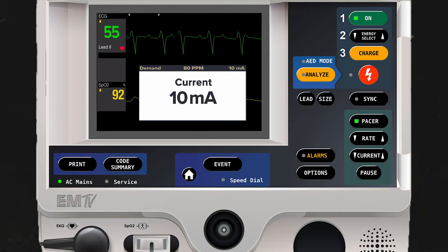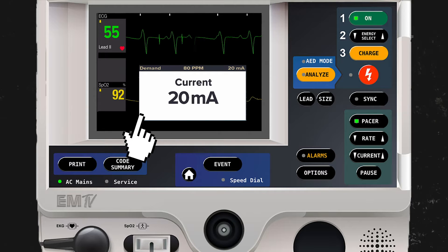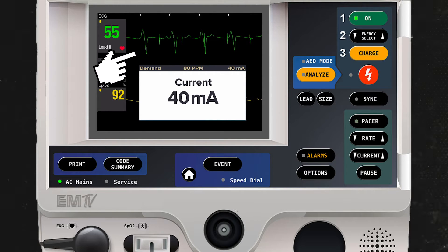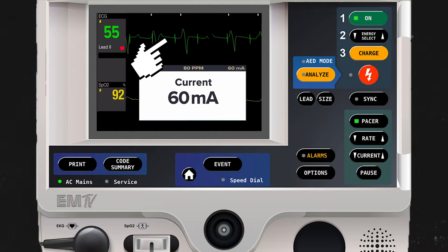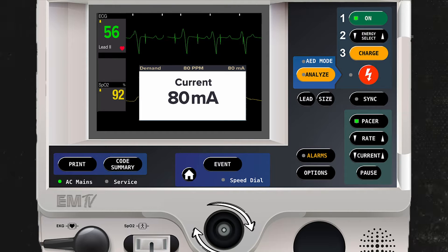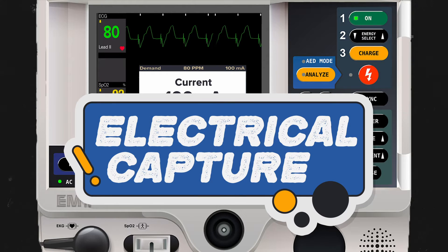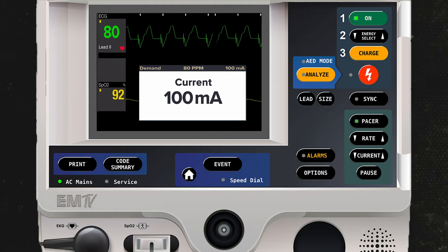On the next screen, I'll increase the milliamperage to begin pacing this patient. As I increase the current, you'll notice the presence of pacer spikes. Pacing is not successful until a pacer spike immediately precedes a QRS complex. Once this occurs, we have what is known as electrical capture. I have always been taught to then increase the milliamperage by another 10 to ensure that capture continues.